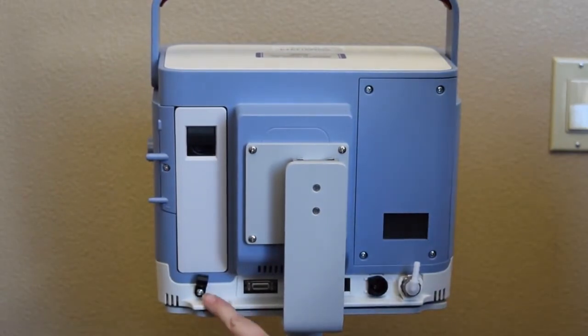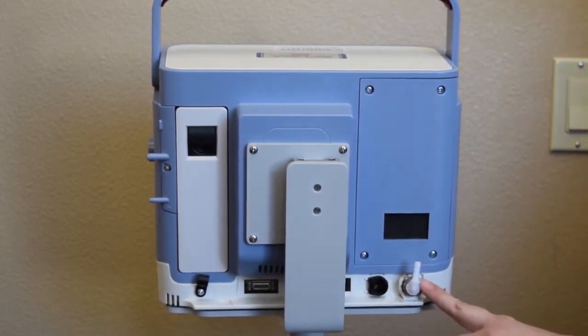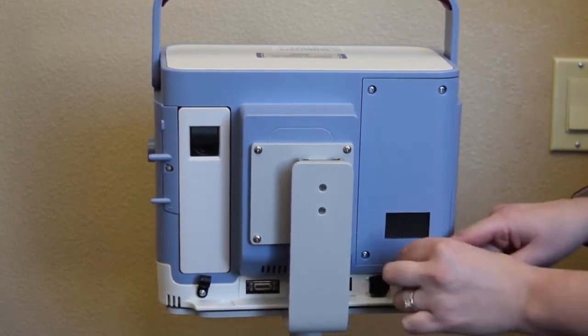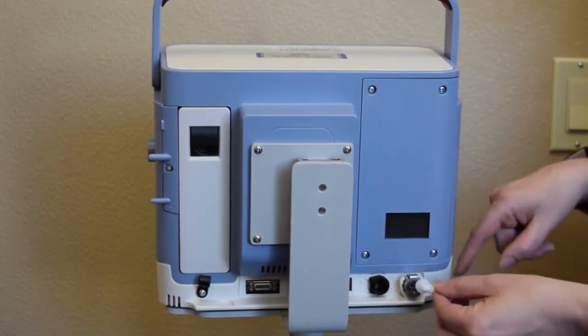This is your power cord retainer, serial net connector, ethernet connector, an external battery connector for your DC power cord, and this is your oxygen valve port. If you press down on this little gray button, the oxygen adapter pops out and you can snap it back in.